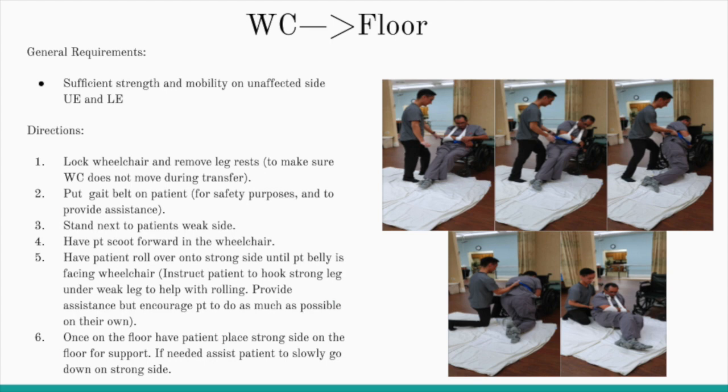Now, I'm gonna present you a video that I made that shows you this transfer technique. And one thing to keep in mind is that you can always modify this transfer according to your patient's needs, also according to their age and their medical diagnosis, if they have precautions and contraindications. So it doesn't have to be exactly the same way I do it. This is just the way I did it.